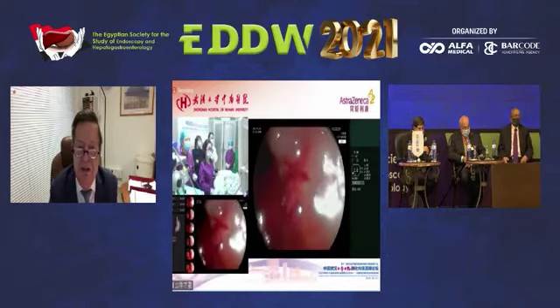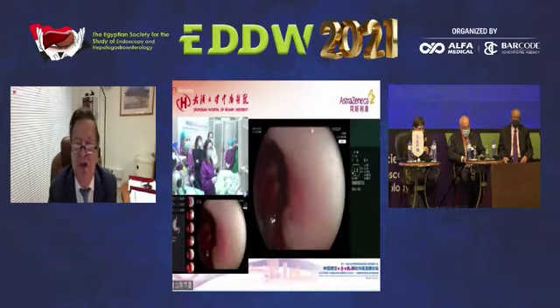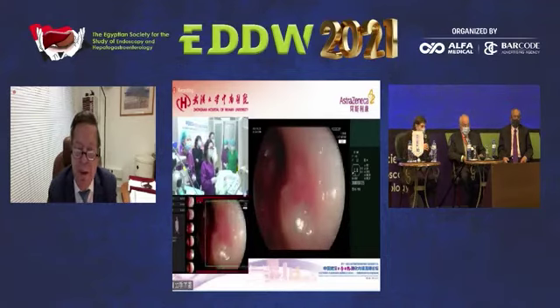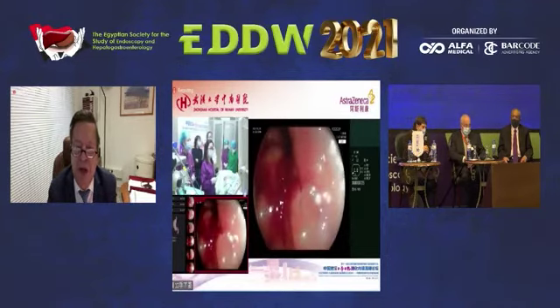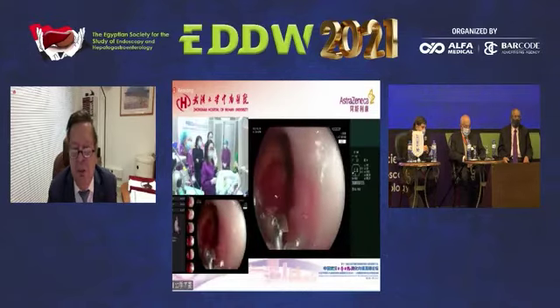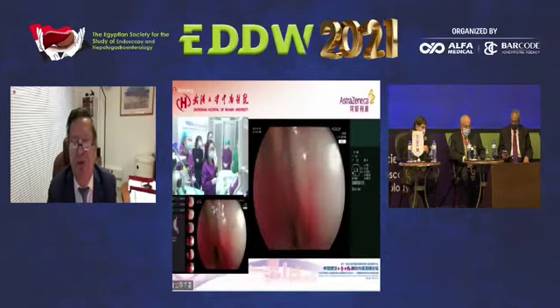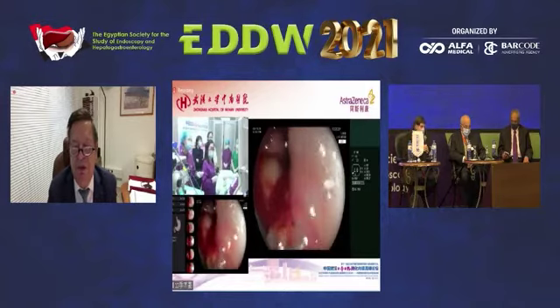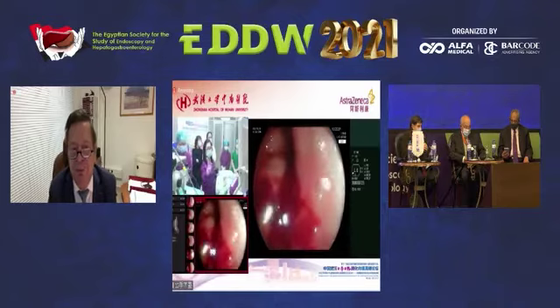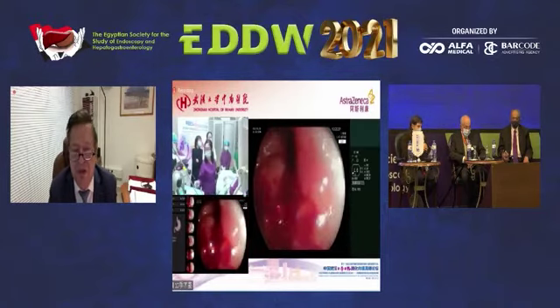Characterization is to make an accurate diagnosis about malignancy, non-malignancy, and the delineation in order to do ESD. So with artificial intelligence, you make a very accurate diagnosis, so you don't need pathology anymore.